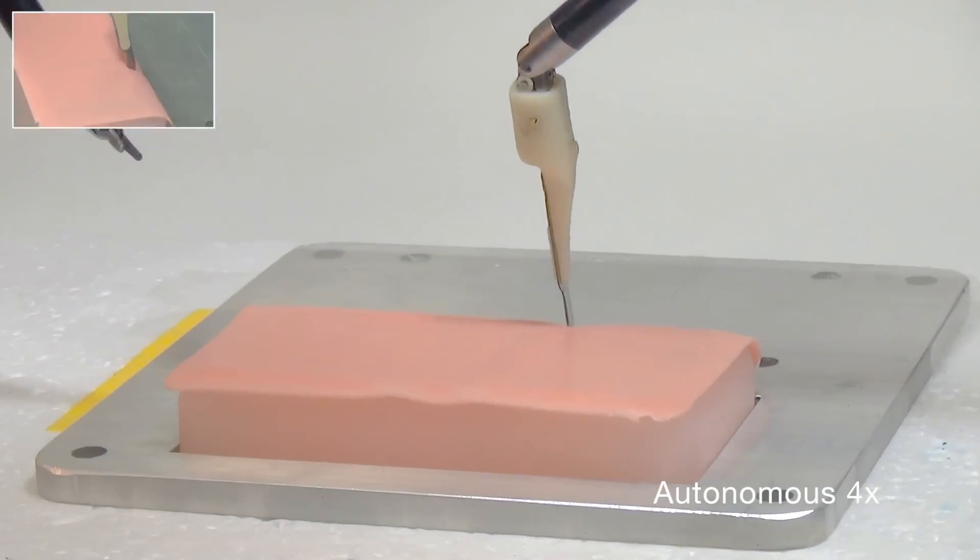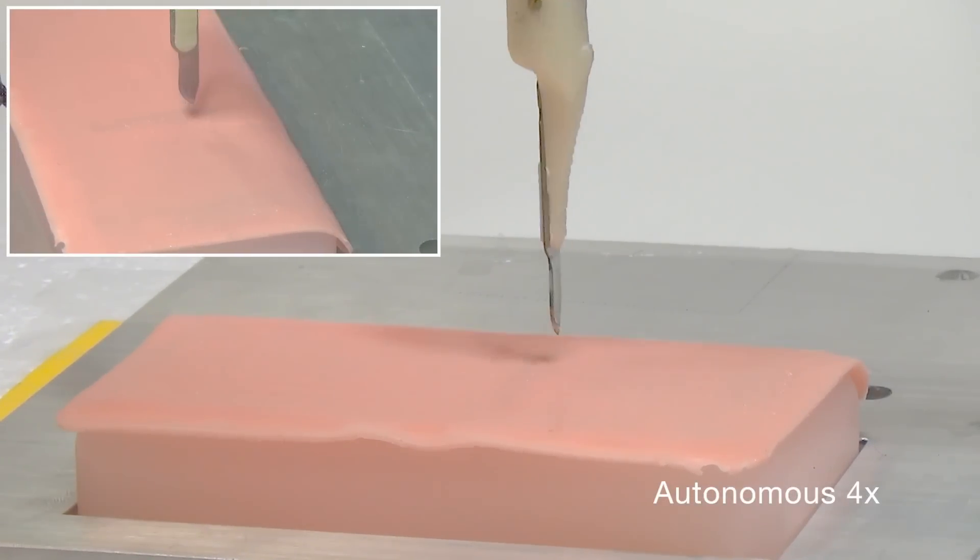The second step is a surgical incision to access the tumor. The system makes an incision at an offset from the palpation estimate using a sequence of short motions, and then sweeping the scalpel along the full incision.